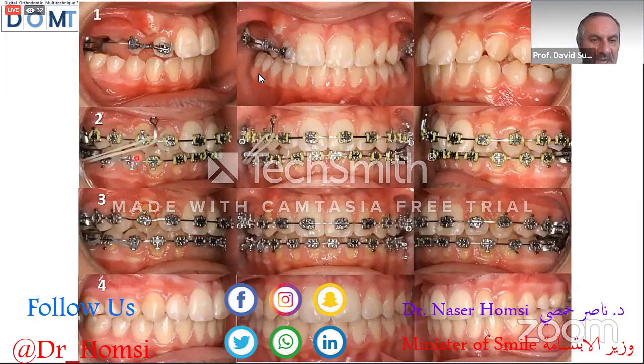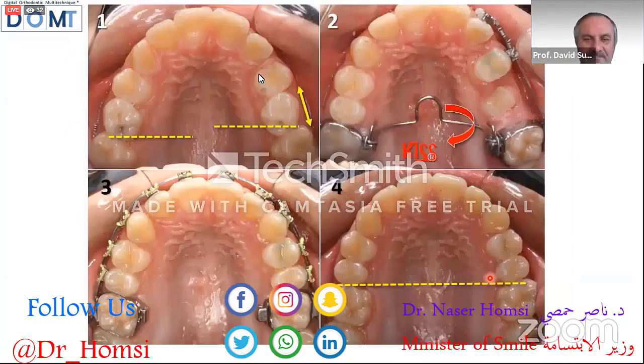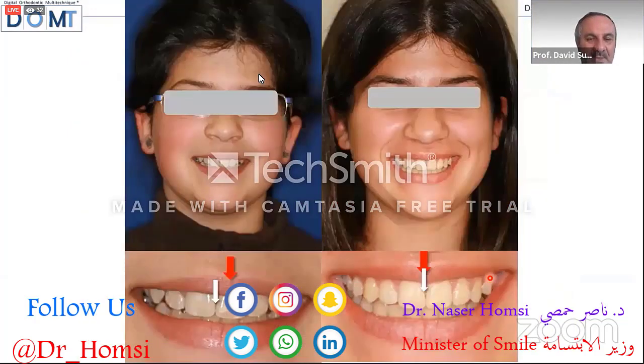Now it's time to put class 2 elastic because the patient presents a dental problem. Okay, shift to the class 2 elastics and finishing the treatment. The same, the big advantage is this. The shift of the mandible, the upper midline to the right. Now we have a very nice upper midline without extractions and with a very nice control of the premolars and the canine.